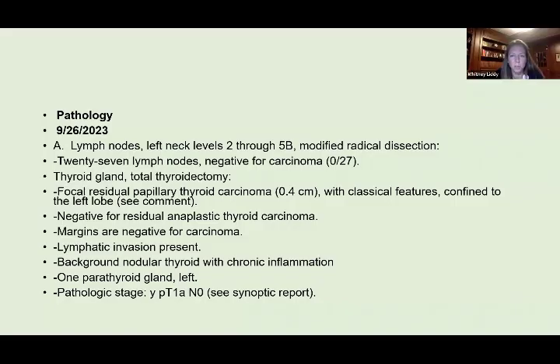And then one other question, then we'll move on. In particular at the ligament of Berry. Joe, you kind of talked about how you like the scalpel, but then sometimes once you get past the ligament of Berry or past where the nerve is safe, you might use a Bovie on the trachea. Does anyone else, what are your favorite instruments at the ligament of Berry? Mark, do you have a specific instrument you want to use in that area?